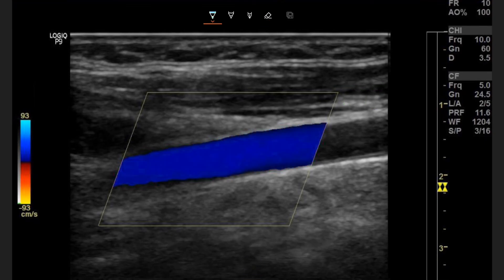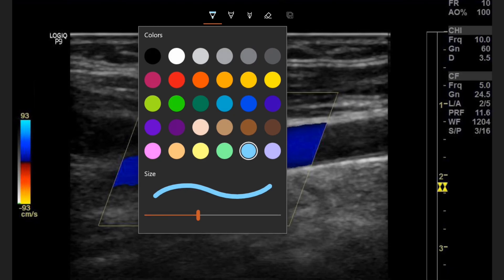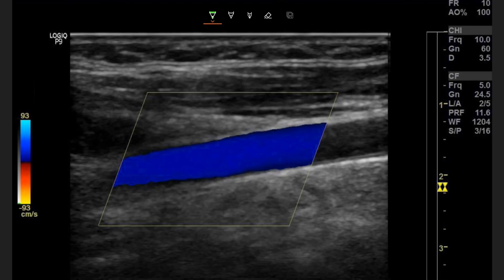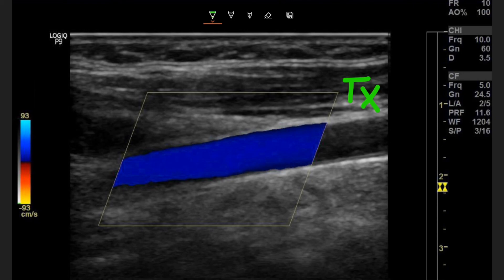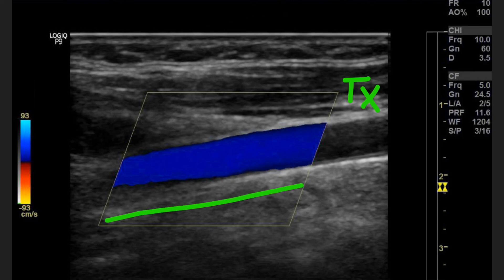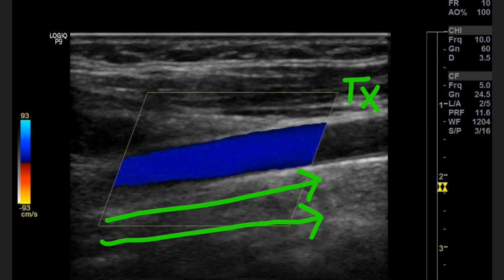Now the color in our vessel is blue. Blue is on the top of our color map, so we're coming towards the transducer. We're going to be coming this way towards the transducer, so the directional flow in this vessel is going to be from left to right.